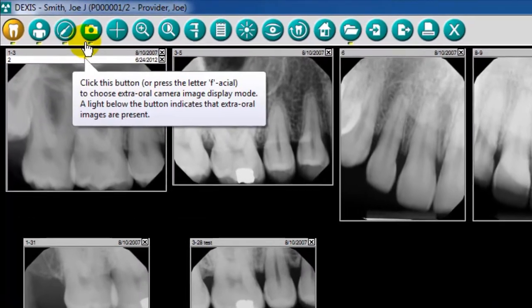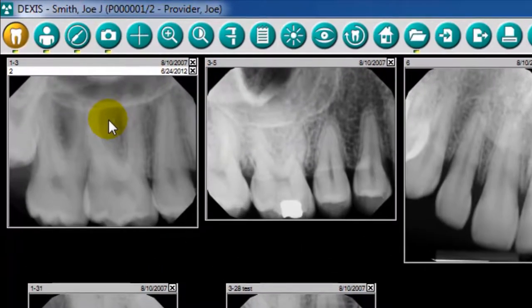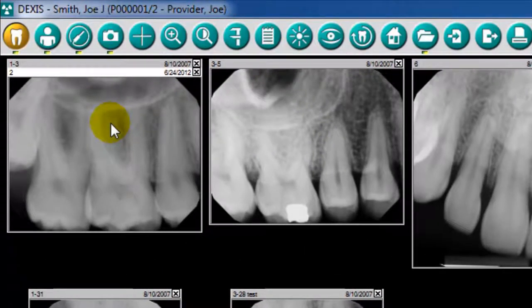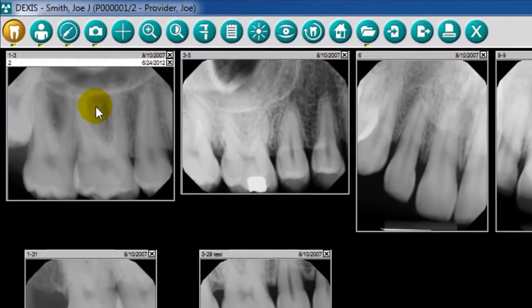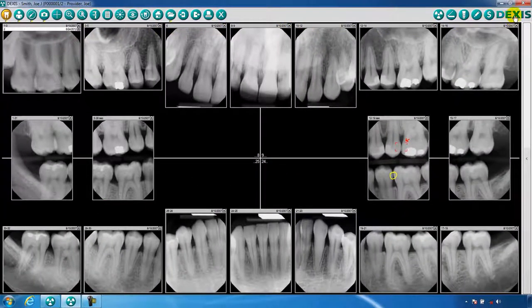Under each icon, you may notice a green light or highlight. This indicates that there are images associated with this particular DEXIS module or function.